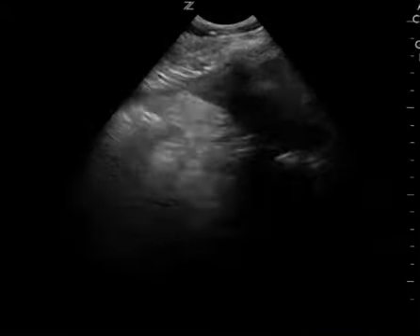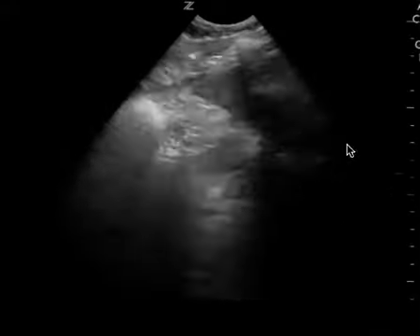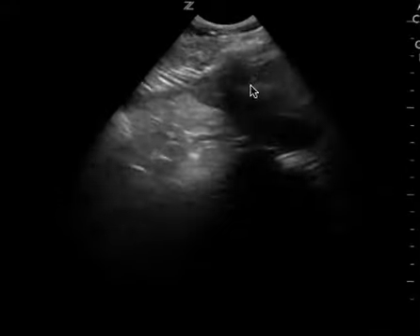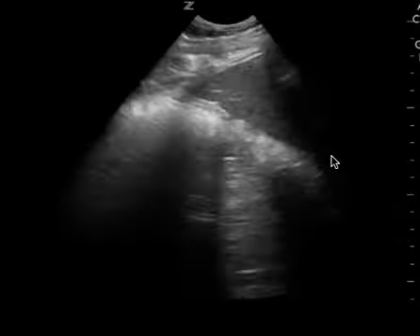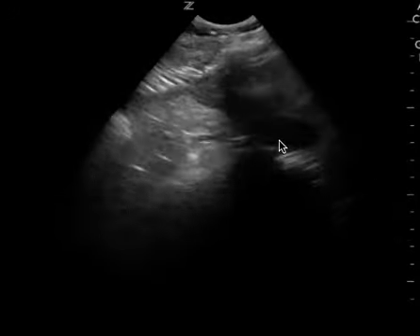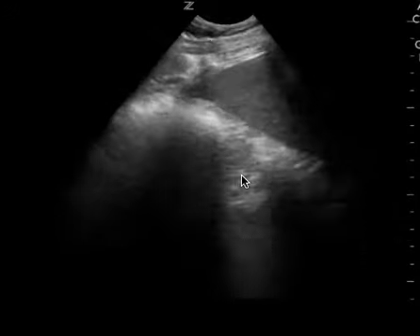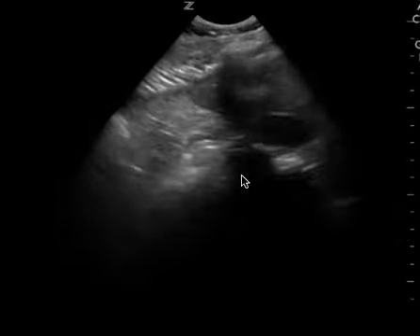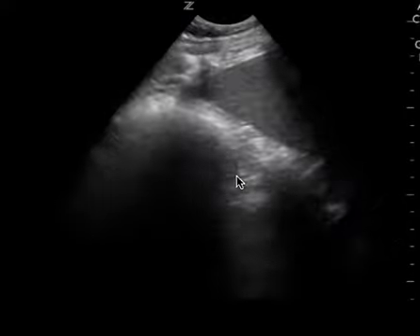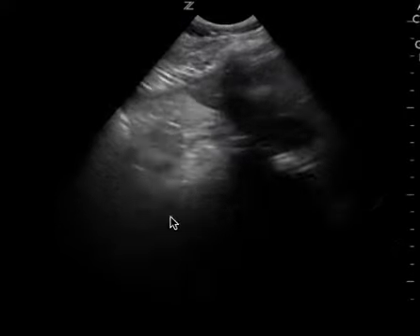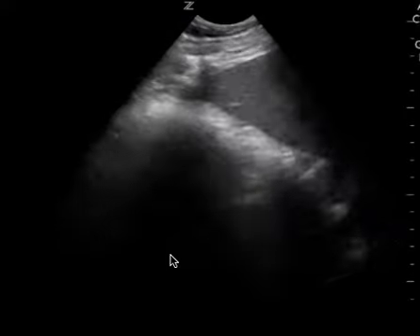This is the FAST exam. This is the right upper quadrant. I want you to focus on the fact that you see the liver here, you see the gallbladder coming to view, but you don't see the kidney. And in addition to not seeing the kidney, the probe is backwards. And so those are the two big things with this.